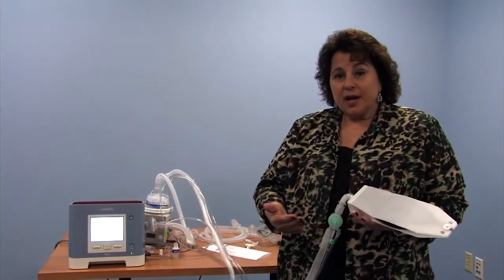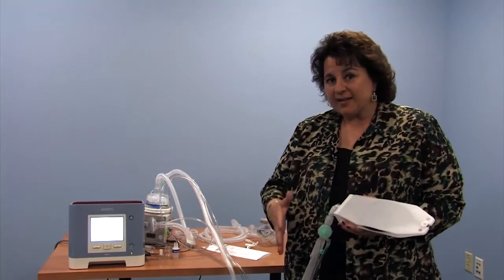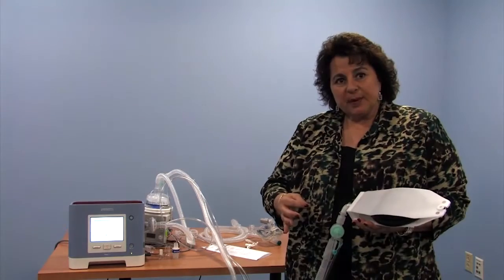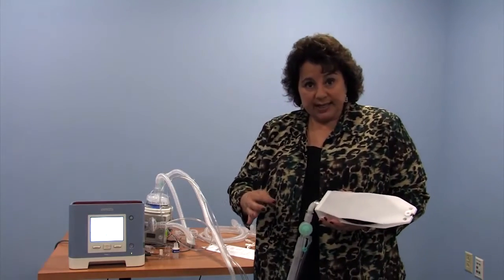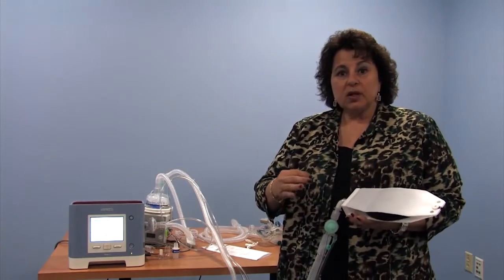So now I think what we're going to do is change over to the different types of circuits for the Trilogy. We're going to talk about the passive circuit, and I'll change the machine to the passive mode so we can look at that. What the Trilogy, because it has BiPAP technology in it, it can compensate very well for leaks.